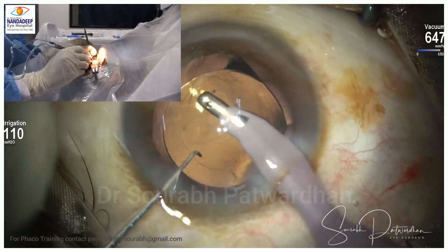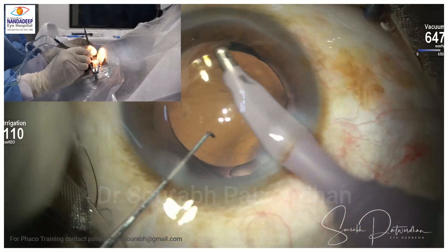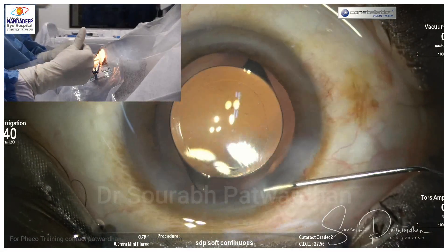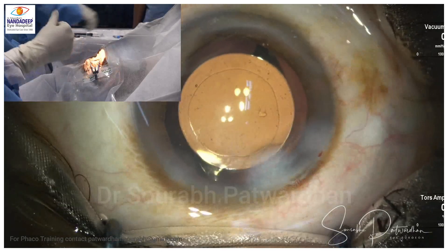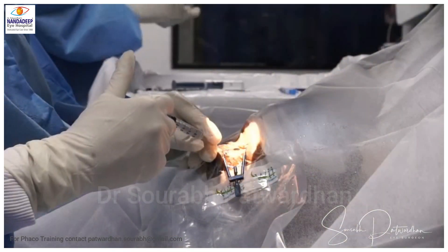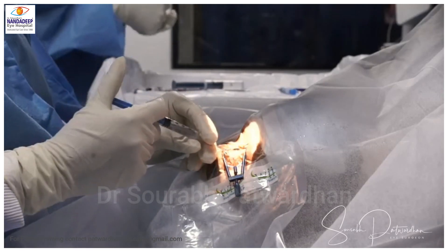Another important point while injecting any fluid in the eye: always hold the hub where the cannula attaches to the syringe, so that the cannula doesn't shoot forward and cause damage to the ocular tissues.